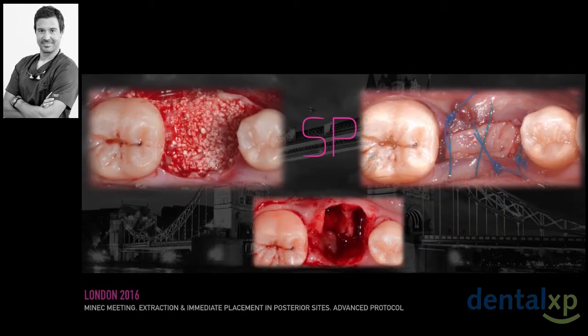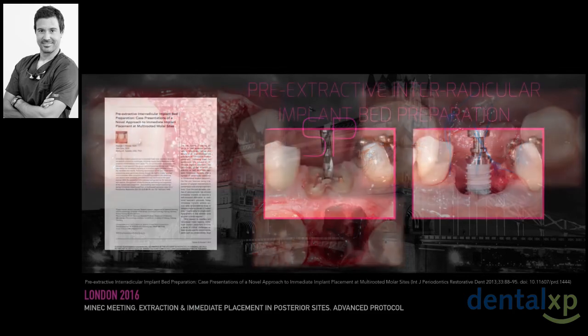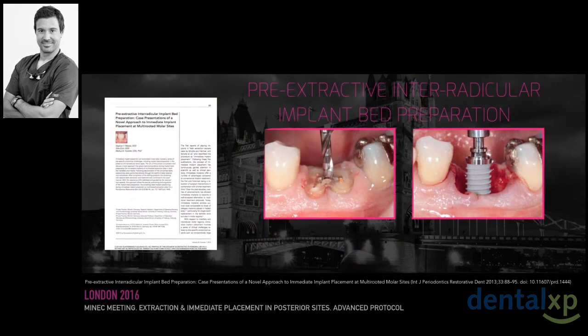So socket preservation with different bone materials, after those studies, became the best and most predictable treatment option in posterior areas, where the fresh extraction socket would leave a big space and a reduced amount of bone to place an implant. In 2013, Markus Hürzeler and his team developed a pre-extractive interradicular implant bed preparation that changed the way I drill today in the molar sites. He showed that drilling through the remaining roots, even on non-healthy roots, would allow the drills to follow a resistant pathway through the bone, which is less dense, in order not to fall into the socket during our drilling. So the roots would drive our drill.